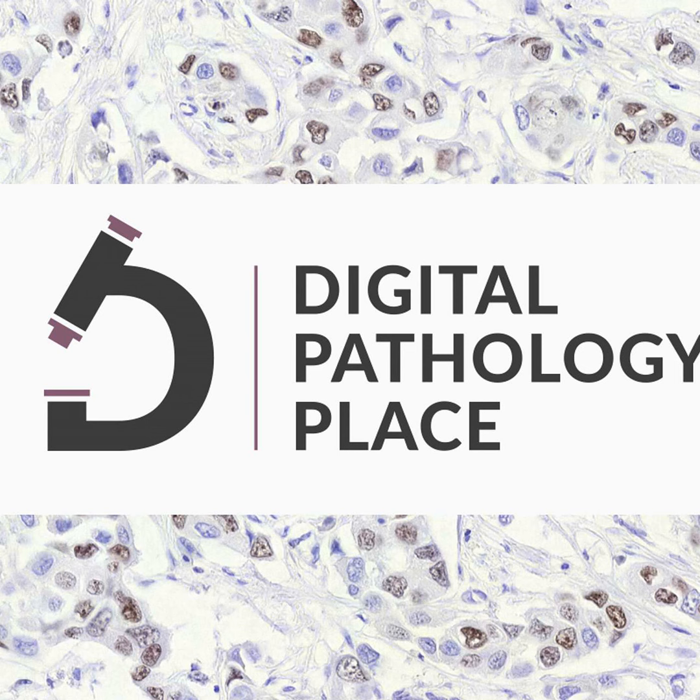A digital pathology system is a computerized system. When in doubt, you ask, what do I do with a computerized system? A digital pathology slide is an electronic record. So when in doubt, how do you deal with electronic records? You have a backup file, you have a chain of custody, not everybody can access it, and you do everything you have to do to be compliant.